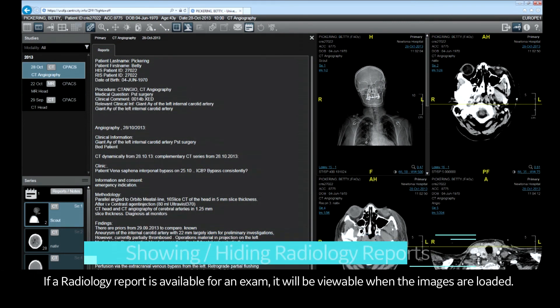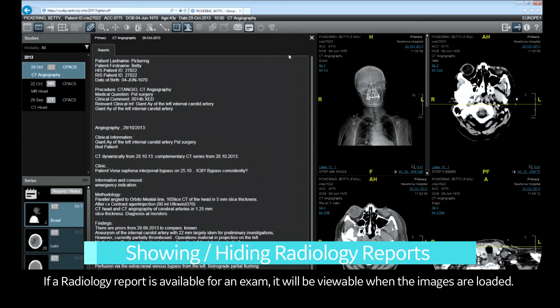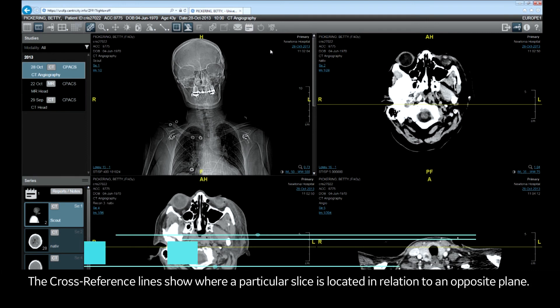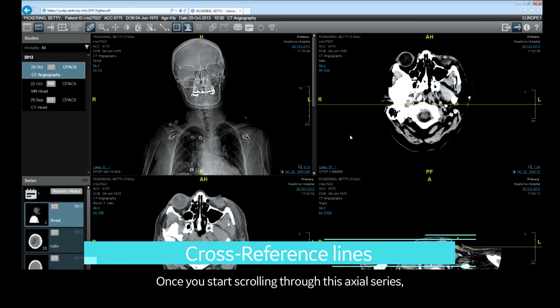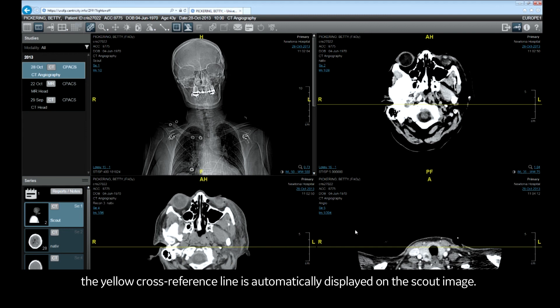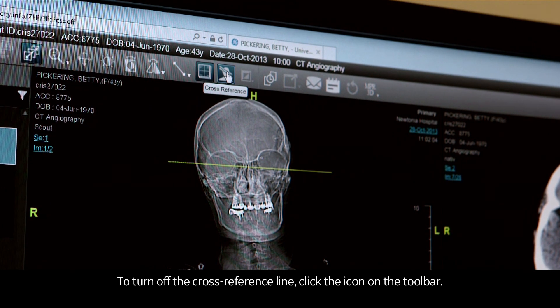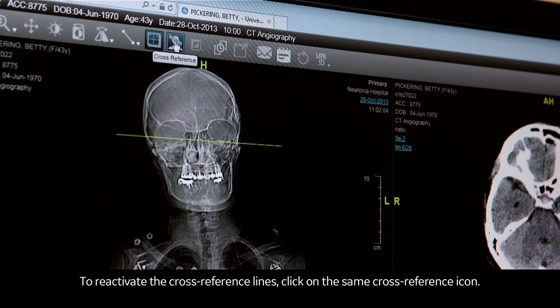If a radiology report is available for an exam, it will be viewable when the images are loaded. Close the report pane by clicking on the X. The cross-reference lines show where a particular slice is in relation to an opposite plane. Once you start scrolling through the axial series, the yellow cross-reference line is automatically displayed on the scout image. To turn off the cross-reference line, click the icon on the toolbar; click the same icon to reactivate it.